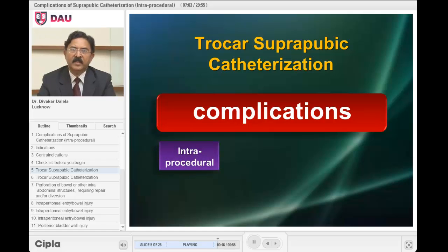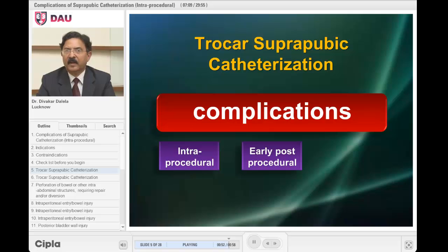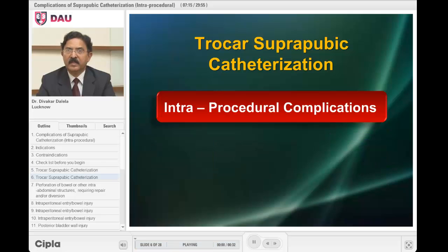These complications can occur at the time of procedure, immediately after the procedure, which are called early post-procedural, or they can occur even at later stages. In this presentation, I am talking to you only about intra-procedural complications.